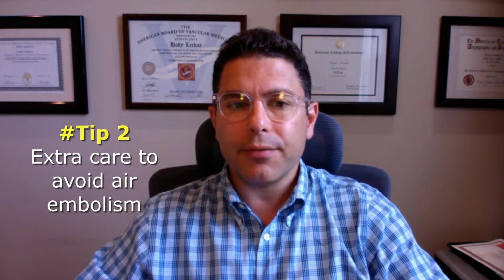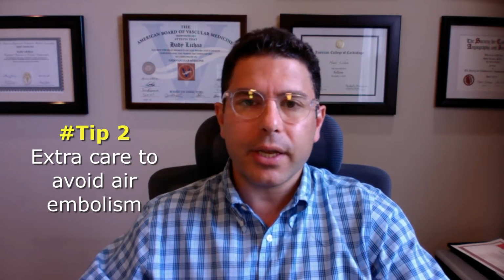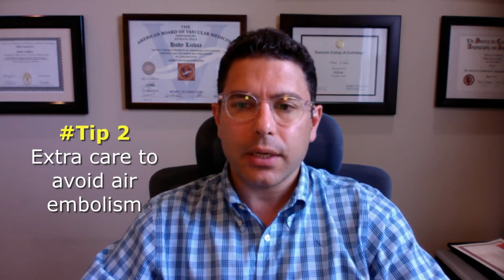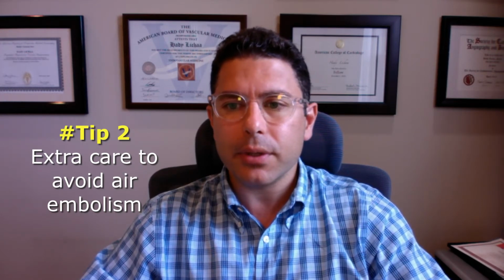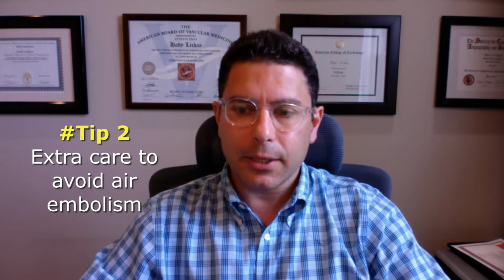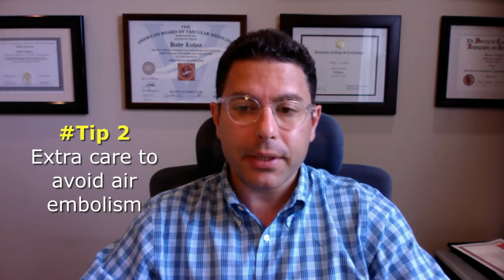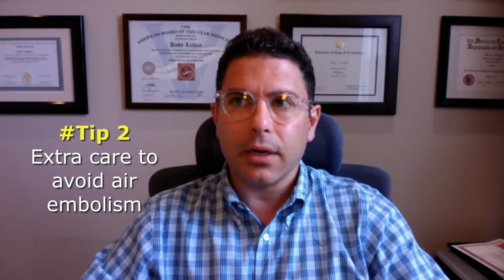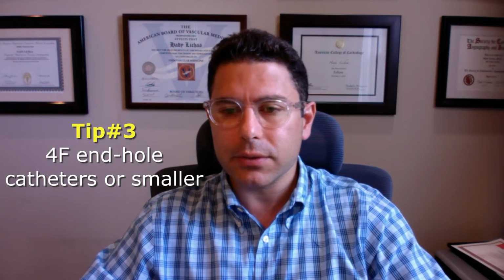Number two, very important to be very careful about the prep. It's very easy to get an air embolism situation if you're not very careful about preparing the system very well. There are multiple systems on the market. Be very familiar with the technical steps.